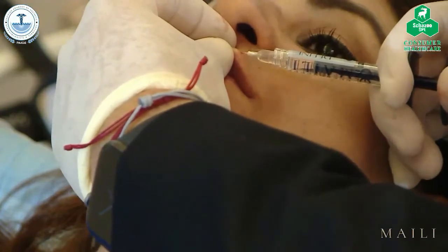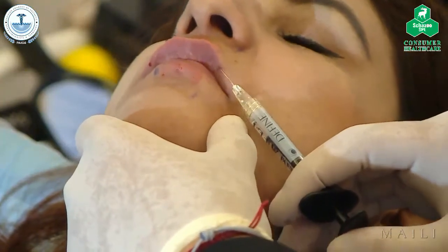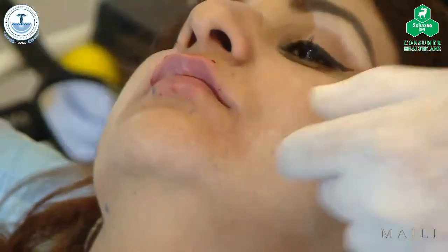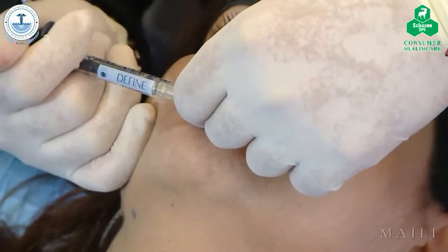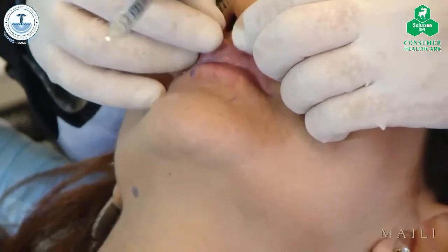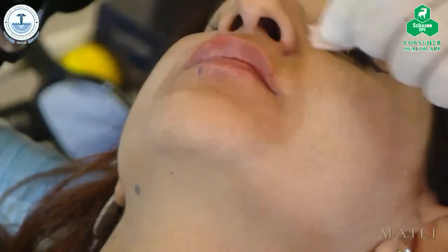So what will happen if someone has injected too superficially with the Maili? Oh, it's not going to happen anything. I think it might have a bit of bumpiness. But with the massage, it's quite easy because there's a very low G prime. It's very easy to spread. But again, when you want to massage it, make sure you don't massage it strongly because the lips are very vascular, and you might end up with a hematoma and bruising. Honestly, I saw that usually my hematomas and bruising are from the needle, not from my fingers. In my case, I've had them with fingers.